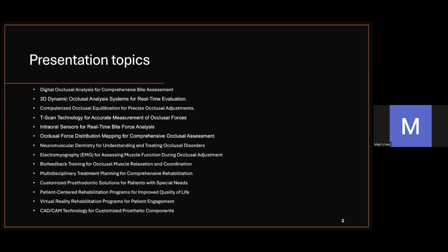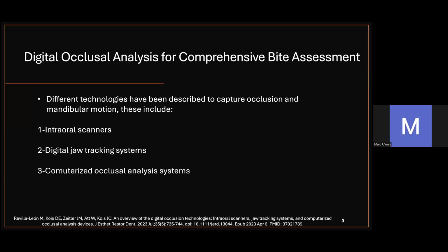Implants and splints. First, digital occlusal analysis for comprehensive bite assessment.